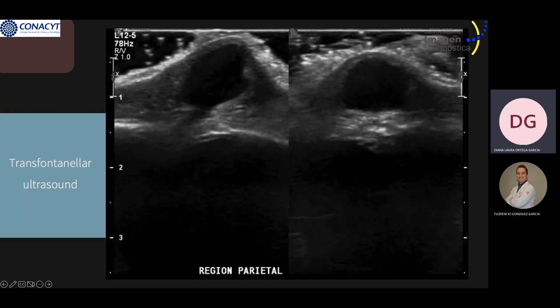In the next slide, some images of the ultrasound are shown, starting with coronal and sagittal views showing a midline parietal cystic mass with a solid fibrous tract through a small area of skull defect about five millimeters, that apparently connects to the meninges.